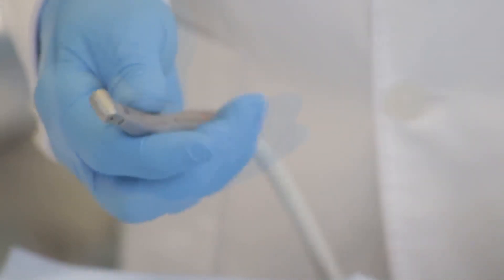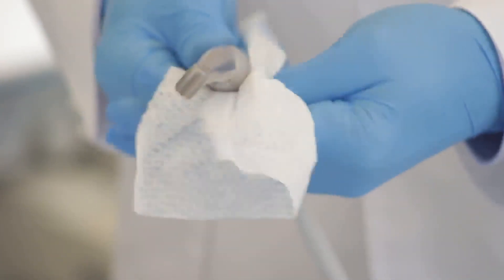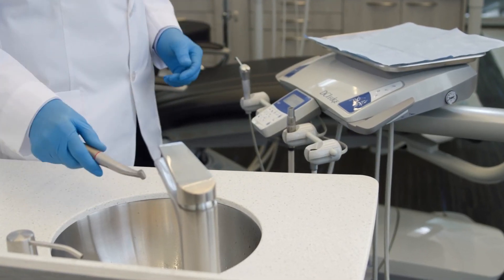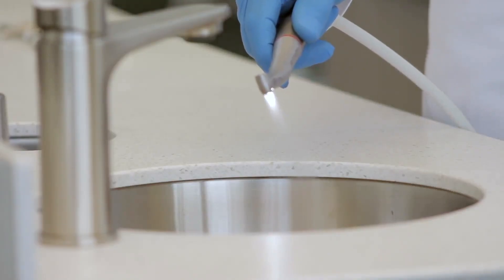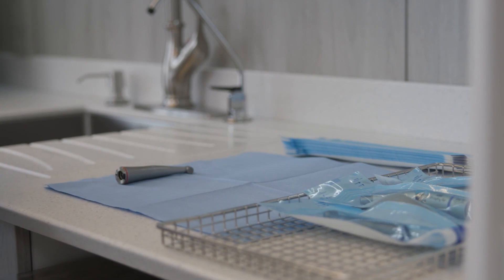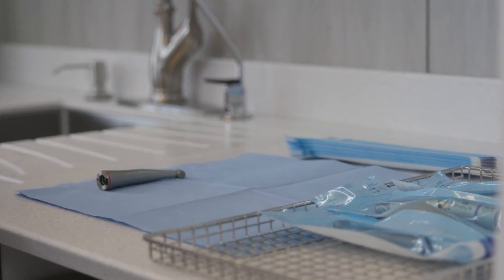Remove the burr. Use disinfection wipes or an alcohol-soaked cloth to wipe the outer surface of the attachment and the motor. Run the attachment without a burr for about 20 seconds to clean the water line. Remove the attachment from the motor and take it to the contaminated area of the sterilization room.